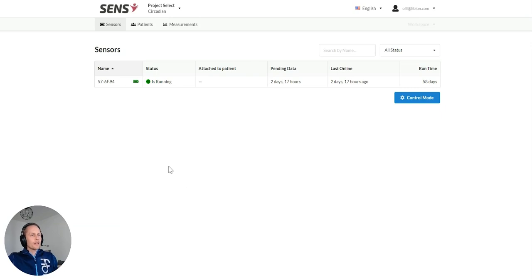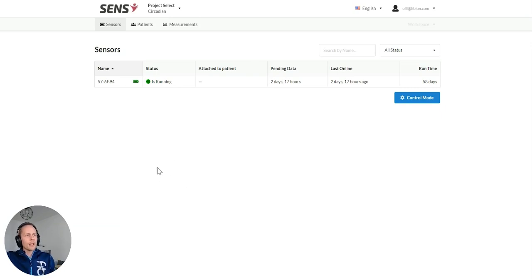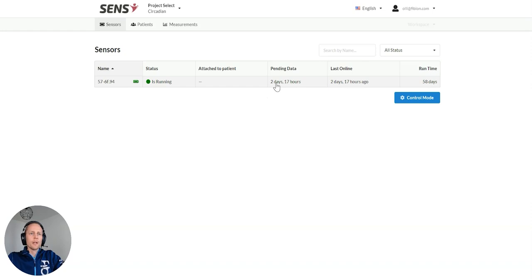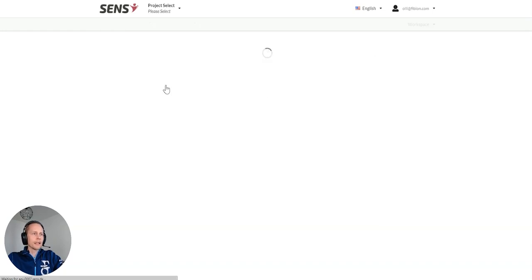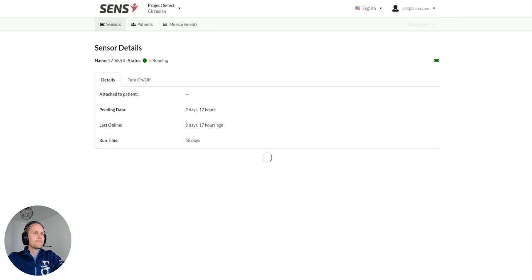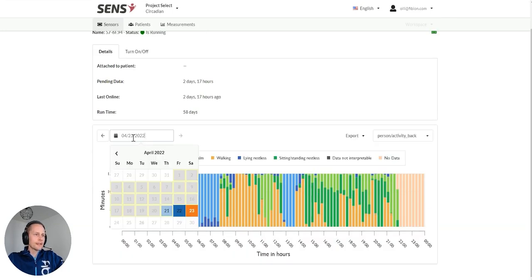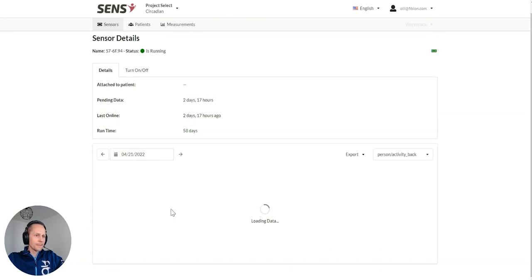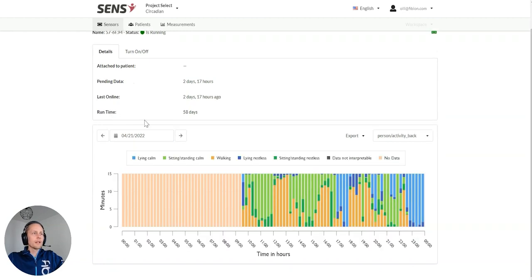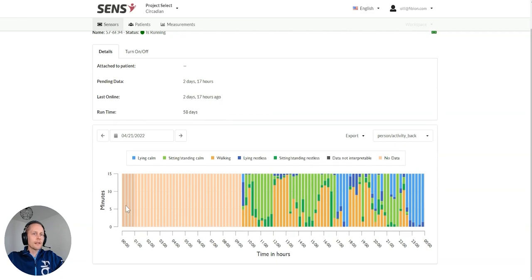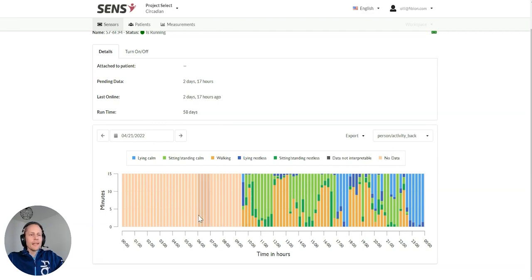Let me show you from our cloud. I'm here now in Fibian Circadian Cloud. In this project I have just one sensor which has been measuring two days. I can click on the device. Then we see the data of this device. The measurement has been started on 21st.